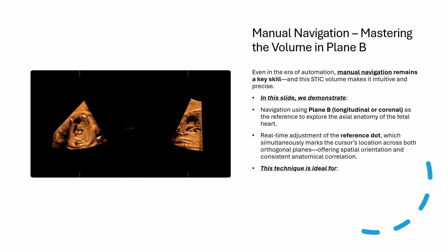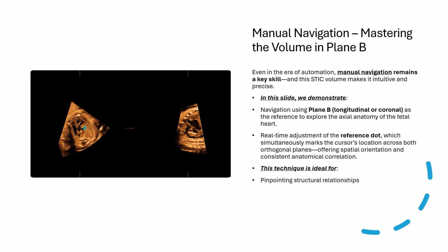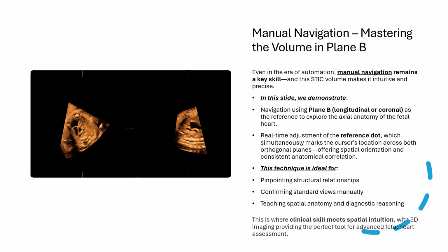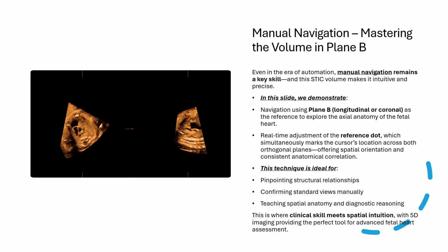This isn't just about looking around, it's about pinpointing key structural relationships, manually confirming standard cardiac views, and teaching spatial anatomy like a pro. This technique blends clinical expertise with spatial intuition, and 3D, 4D, and 5D imaging give you the playground to master it. Welcome to the manual mode.